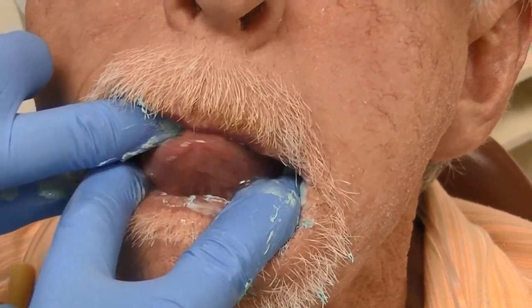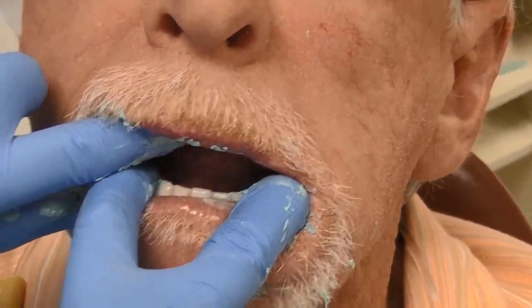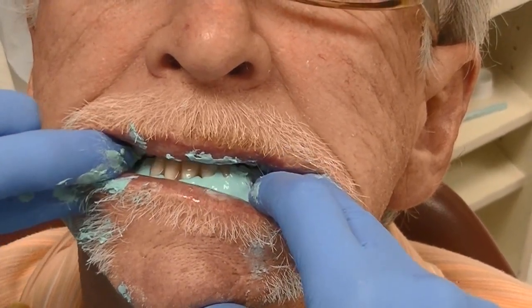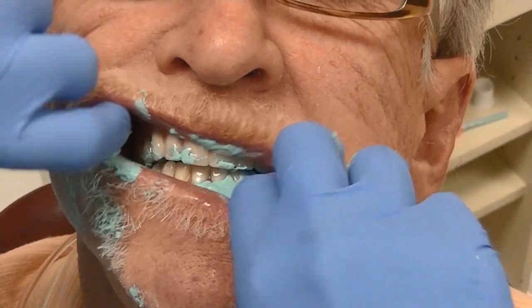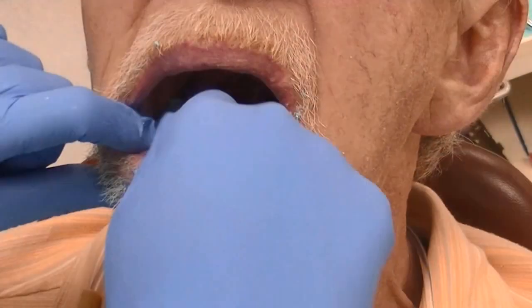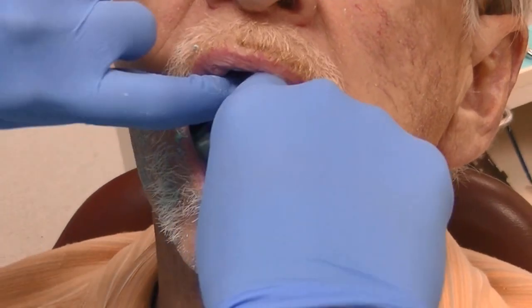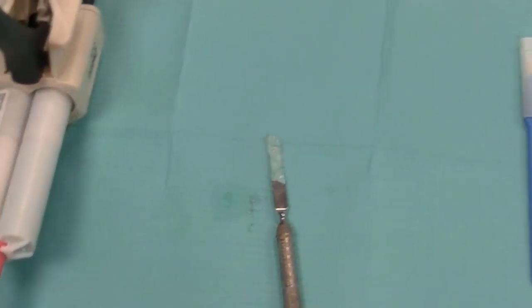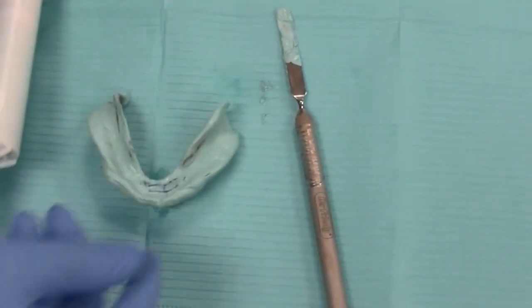Completing border molding using the tongue, we have the patient stick out the tongue, move it side to side, bite down, and then gently swallow a little bit. We complete the cheek side and lip side border molding. The impression material is removed after approximately three to four minutes, and then we can take it back to our counter and do some slight trimming of our radiopaque PVS material.